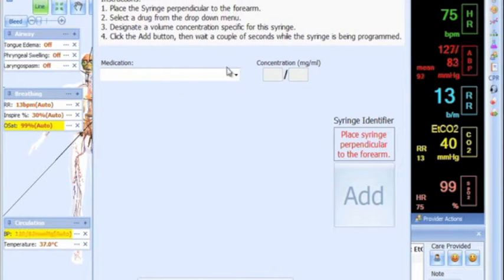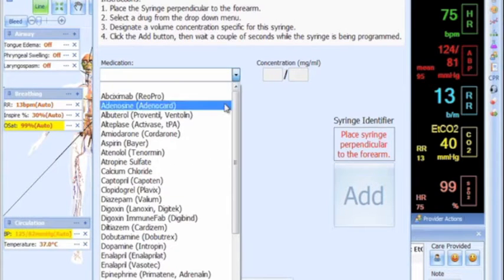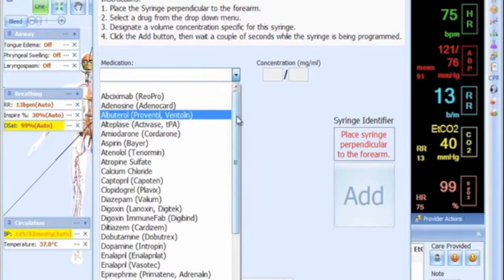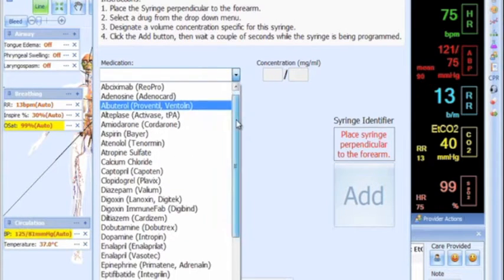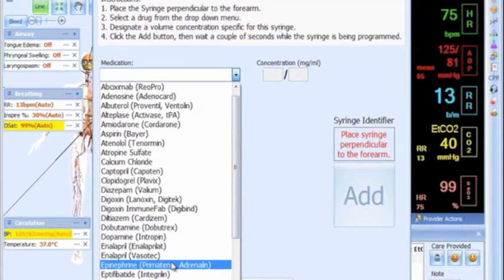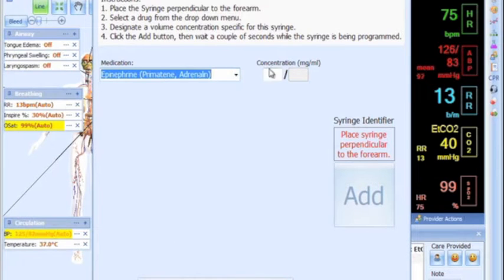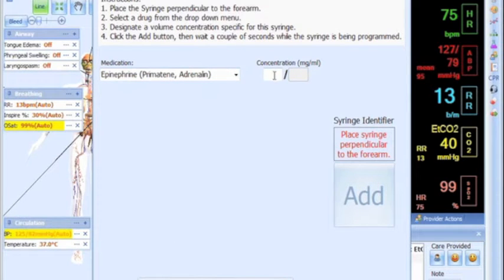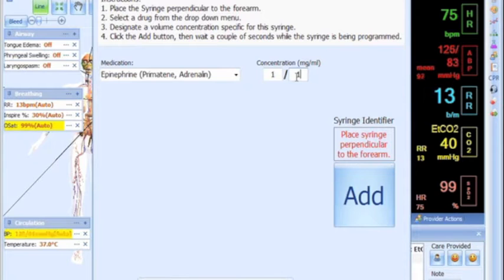Connect to Howell using the GIGA software and then touch Setup. Select Set MedID and choose one of the drugs in the drop-down menu. As an example, select epinephrine and assign a concentration — one milligram per milliliter.